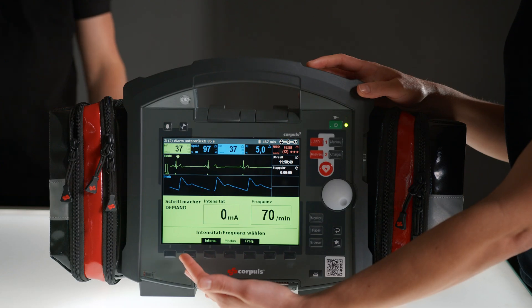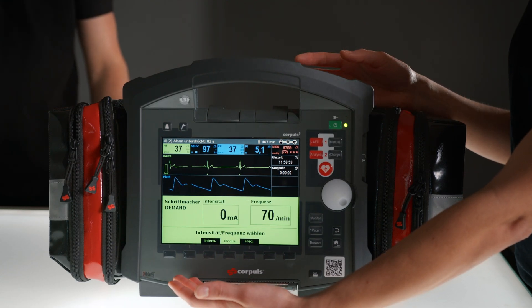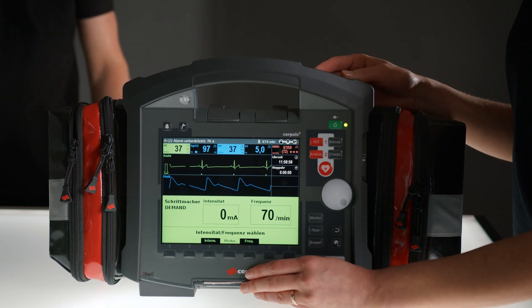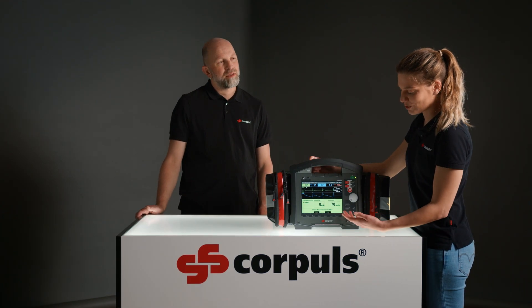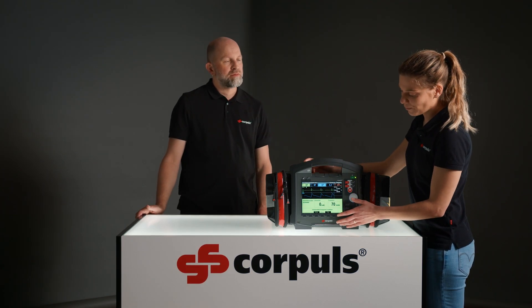On the left of the display, you can see that we are in demand mode. This is the mode in which the device starts automatically and in which we will now demonstrate the further procedure. If I want to change the mode, I can do that by pressing the corresponding soft key here in the middle. On the right side, you can see the preset frequency. It's currently set at 70 per minute, which works for us, so I'll leave it as is.